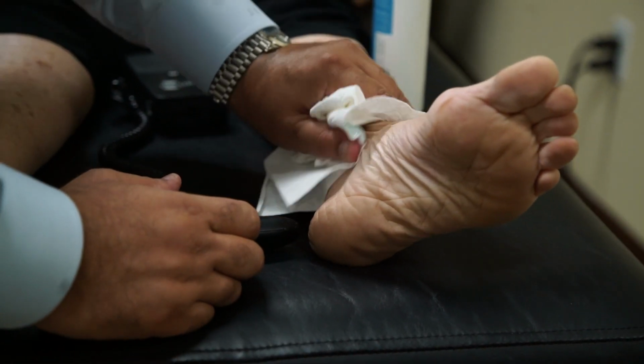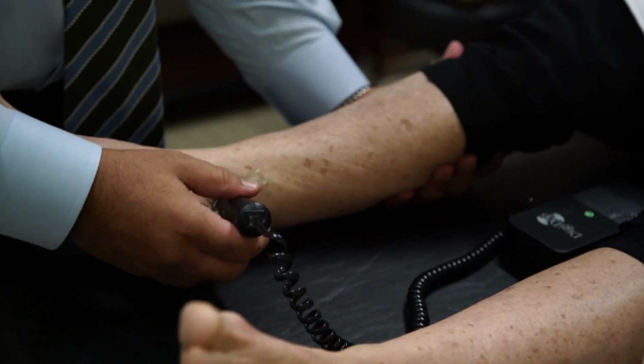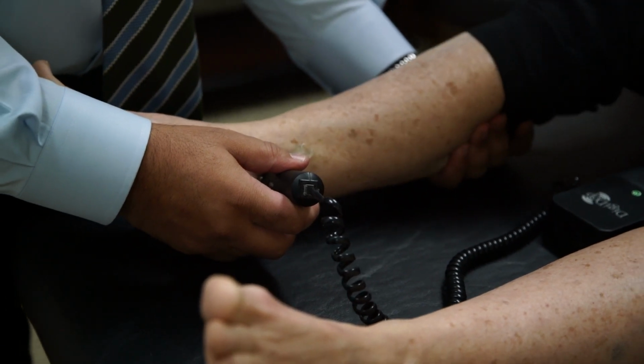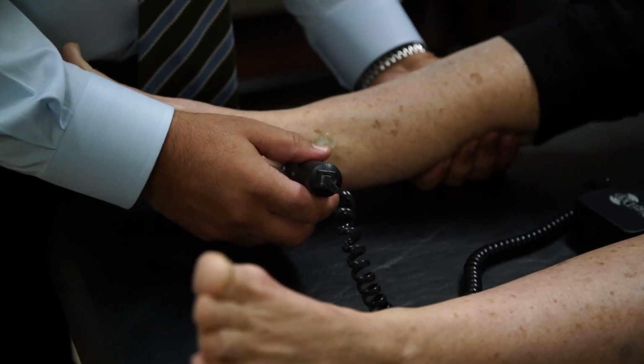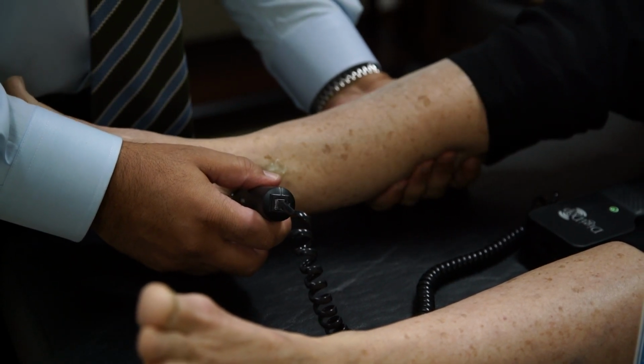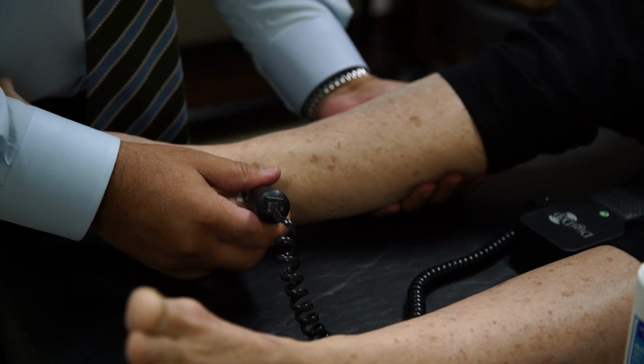So you can see examination of her tibial artery and vein with the Doppler really showed that her pattern of venous and valve integrity is compromised. When you squeeze the calf muscle, you really shouldn't hear anything in those tibial arteries. But if the valves are not working well, you'll hear that swish sound. It was much worse on the right leg than the left leg. But this further confirms the diagnosis of chronic venous insufficiency.